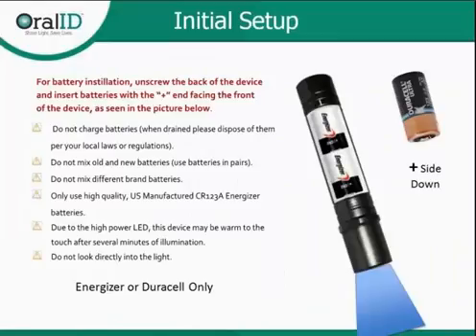When you put the batteries in, the positive goes down with 2 of the batteries. So you just unscrew this end piece. It's called the tail cap. The button is also at this end, and then you just drop the batteries in. When you turn the device on, it should be a constant, steady, bright stream of light. If it's flickering or it's not really bright when you initially set it up, then go ahead and unscrew the tail cap, take the batteries out, put them back in, make sure that both positives are facing down, and then try it. Because sometimes that tail cap just isn't screwed on very flush. If after doing that troubleshooting it doesn't correct the issue, then give us a call and we'll see if we can help correct the issue.